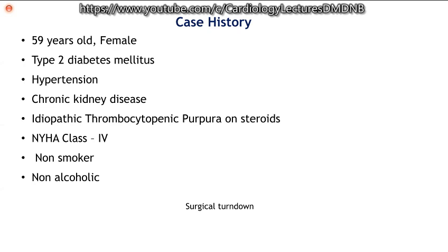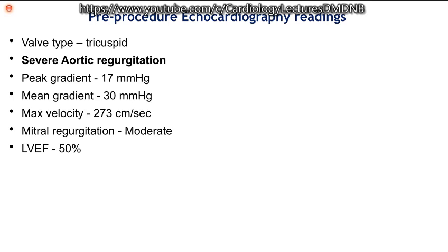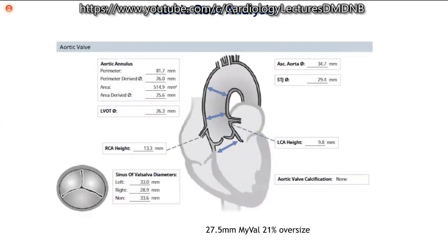for a TAVR procedure. So let's look at a patient: 59-year-old female, diabetes, hypertension, CKD, and ITP, on steroids, with severe aortic regurgitation, recurrent admissions with NYHA class 3 and 4, and the patient was a surgical turndown, mainly due to ITP, steroids, frailty, and presence of chronic kidney disease. So let us look at the CT scan of this patient. The area of the annulus is 514. The area-derived diameter of the annulus is 25.6, and the LVOT size is 26.3.